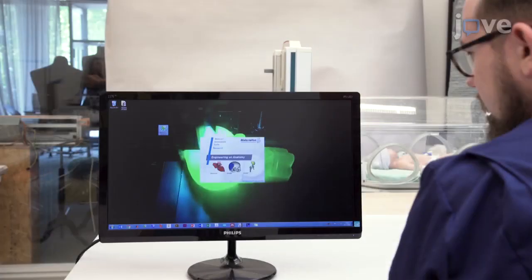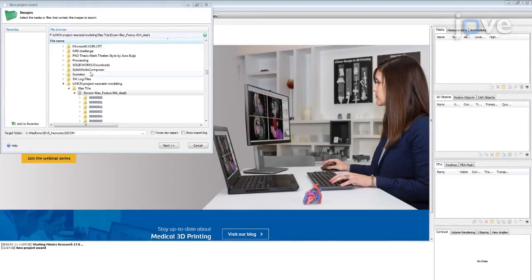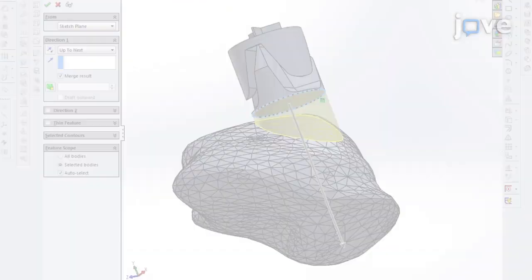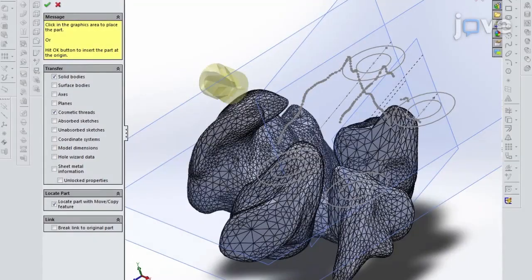To acquire image segments of a representative neonatal heart, first open an appropriate processing software program and import a neonatal thoracic magnetic resonance image, or MRI, formatted as a digital imaging and communications in medicine file. Using the Editing Masks tool, select the area of the heart muscle on each MRI slice where the heart is present and create a new sketch layer.